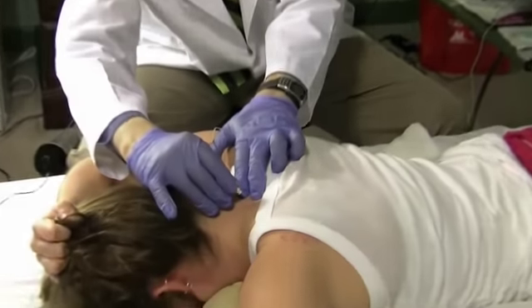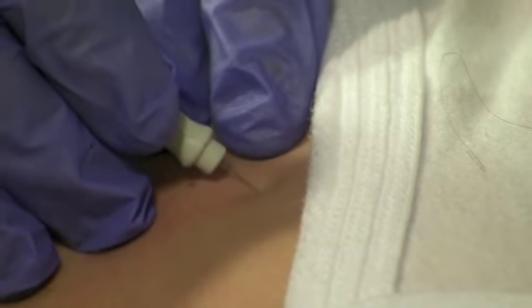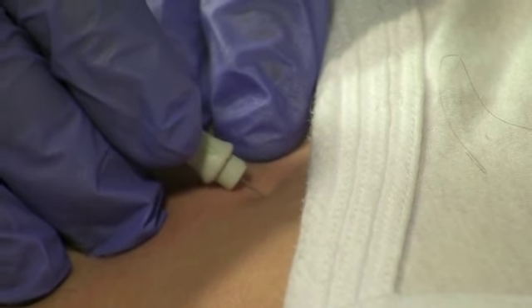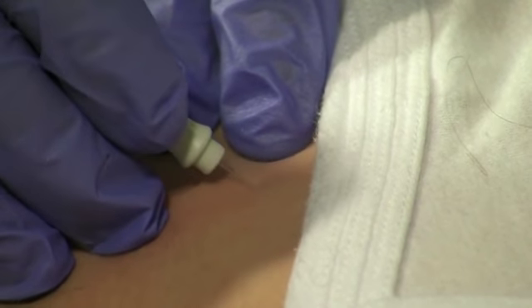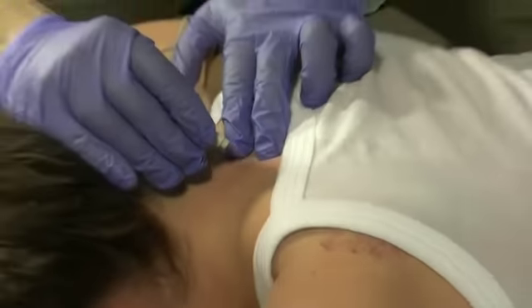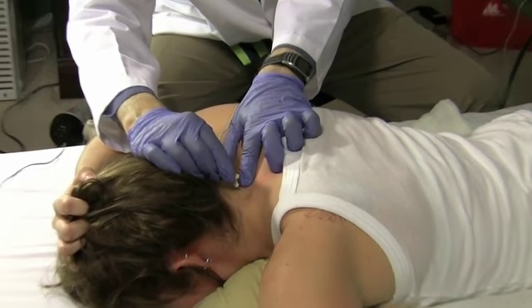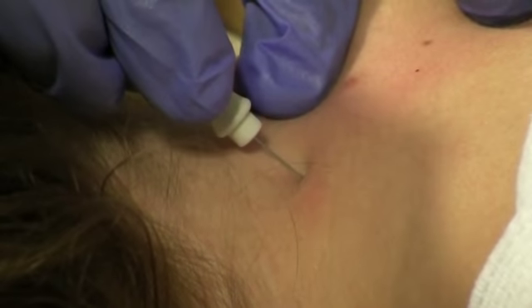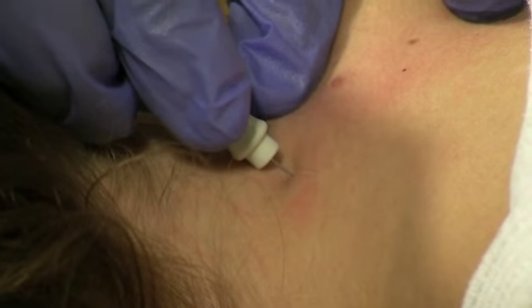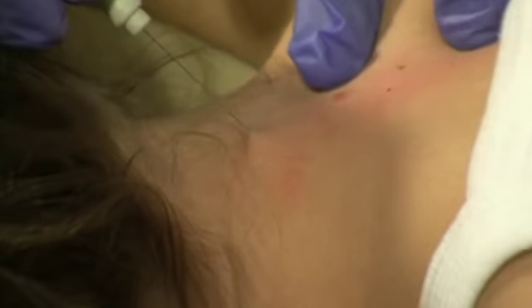Okay. C8, here we go, 1, 2, 3. Relax, put your head down. Perfectly normal insertional activity. And then I do C6 here, one level above. And again, perfectly normal insertional activity.